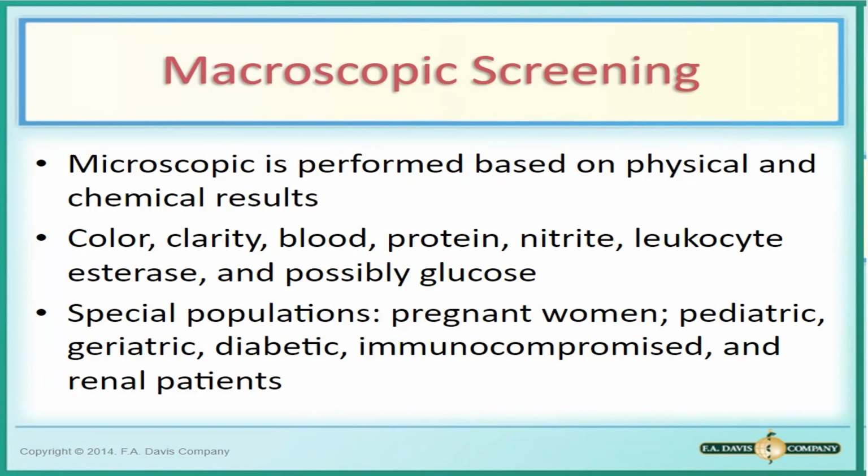In the Philippines naman, routinely, hindi po natin ginagawa ang macroscopic screening. Routine sa Philippines talaga na mag-move forward sa microscopic lahat.